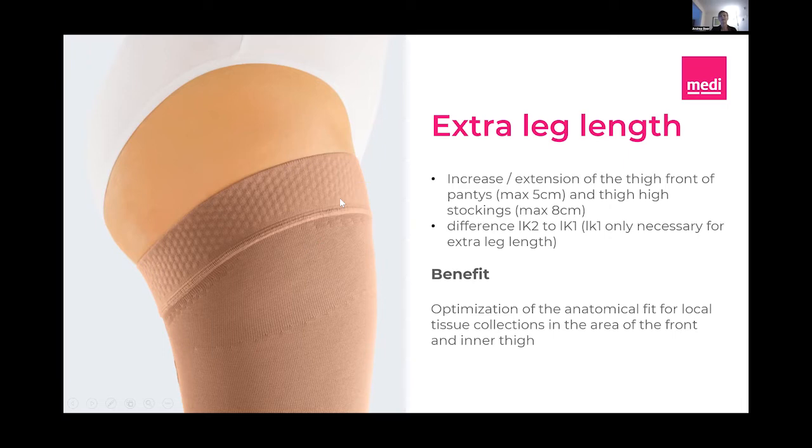Also, we can open up the top band. If there's a lot of tissue sitting around the hip area, for instance, I tend to create a bit of a V shape with the stocking, so that when you sit down and get back up, we're not instantly having the tissue on top pushing the band down. So if you create this V shape and open the top band up a little bit wider, it hugs the tissue a little more gently, and it tends to stay up a little bit better.